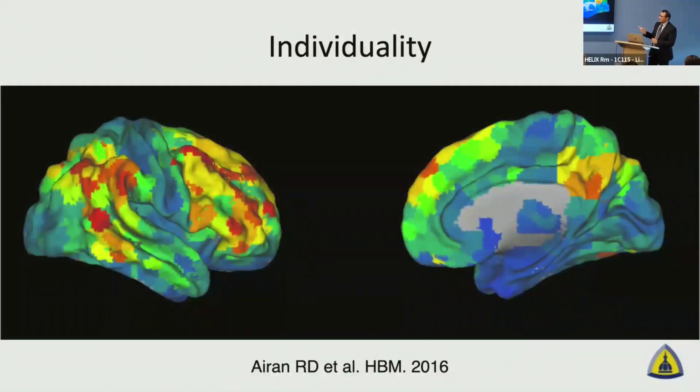And this initially started off as a reproducibility study on individuals. And then the resident, who's now at Stanford, really took this project out far and got some really interesting results. So what we ended up doing was we had 2 scans per each patient or subject.